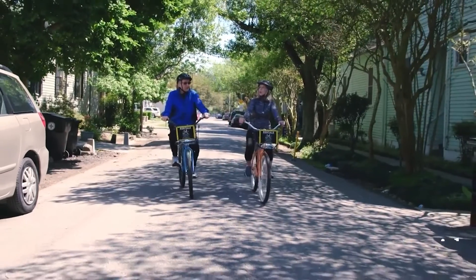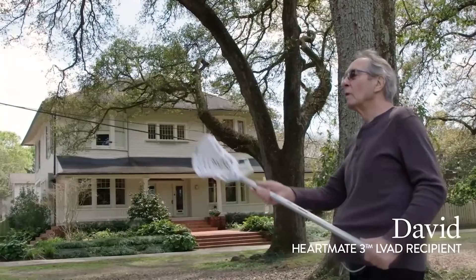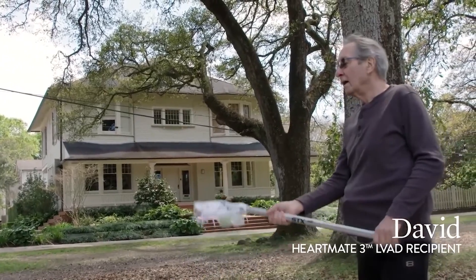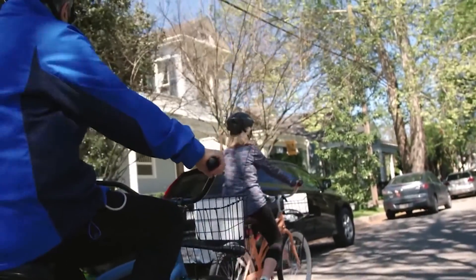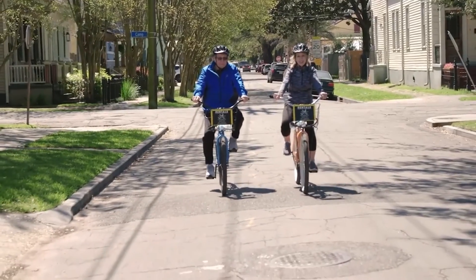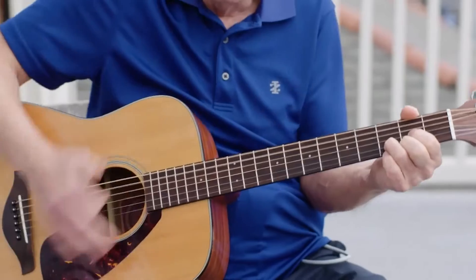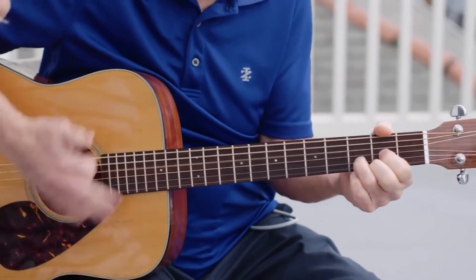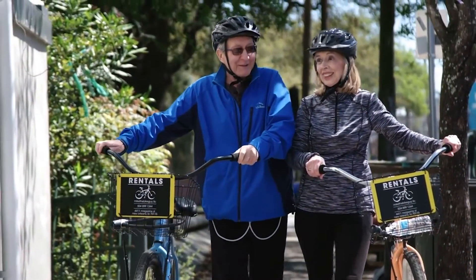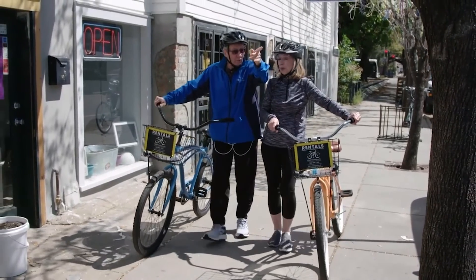Ever since I have had my HeartMate 3, every day has been just amazing. I have not been in the hospital for my congestive heart failure at all. It just makes such a difference because you are getting a flow of blood now. I started biking at 10 weeks. At 21 weeks, I started golfing again, and then at 10 months, I was skiing. Your LVAD care team will continue to provide ongoing training and monitoring needs for as long as you have an LVAD.